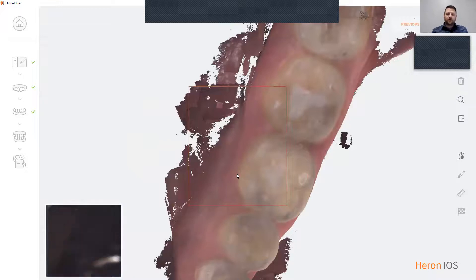Another nice function of our scanner is it has an intraoral camera function. To use that, simply place the scanner over an area that you would like to take a picture of and click the letter C on your keyboard to take a picture.